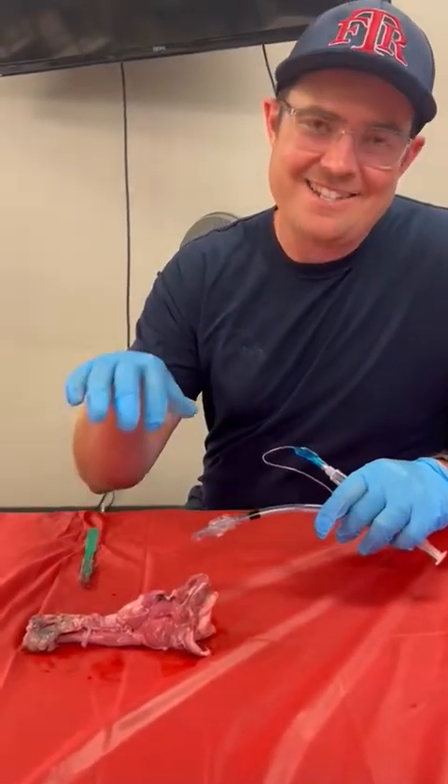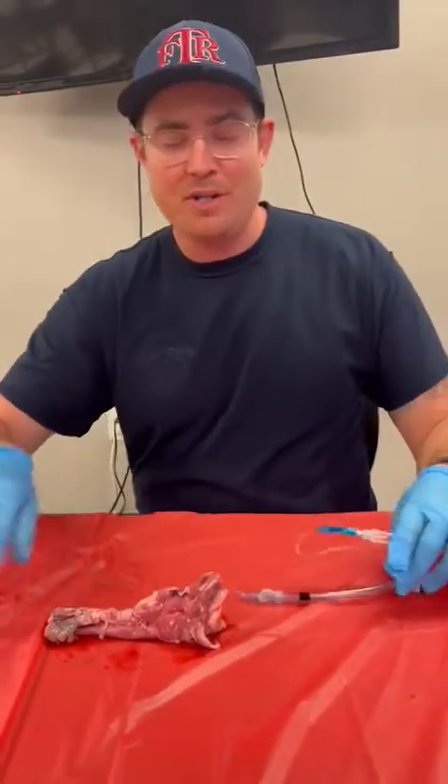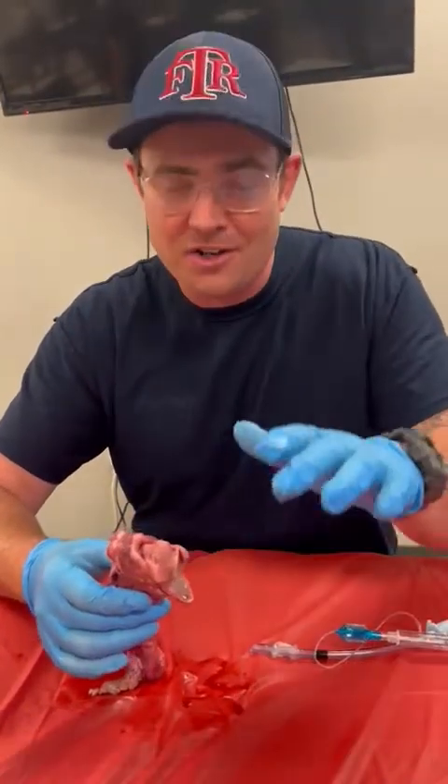What we're going to be doing today is talking about cricothyroidotomy. The reason why we'd want to do a cricothyroidotomy is because we are unable to obtain an airway any other way. We've tried intubating the patient, we've already tried ventilating the patient, nothing is working at all — so we're going to be criking.